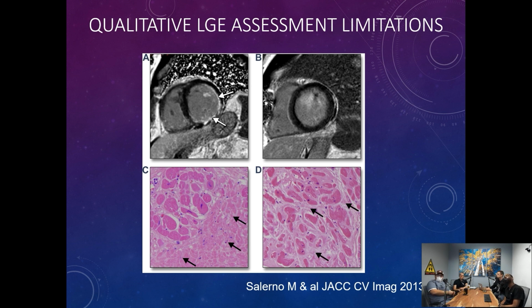So in this case, if we're seeing delayed enhancement, it's subendocardial, it's in a vascular distribution like left circumflex. Those are all things telling you this person has a big infarct. And you look at it and say, there are areas where it's transmural, more than half the wall is involved. You can revascularize that region, and there's a high probability it's not going to make a difference. But there are other regions where more than half of the myocardium looks like it's still alive. So if you revascularize, that area might perk up, and the ejection fraction might come back up.